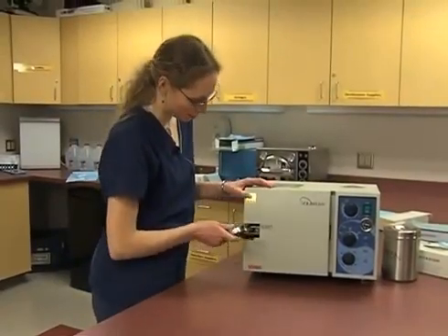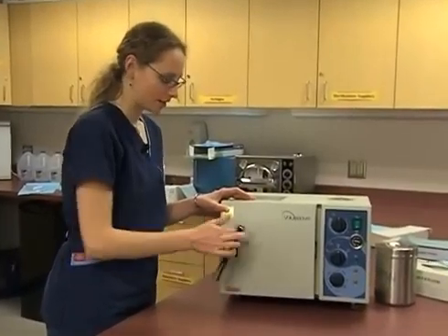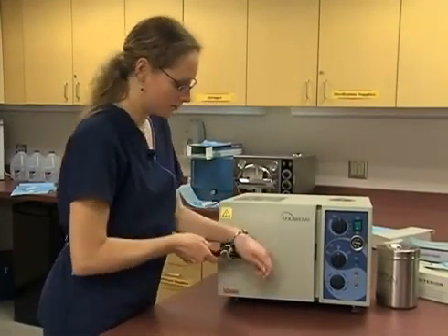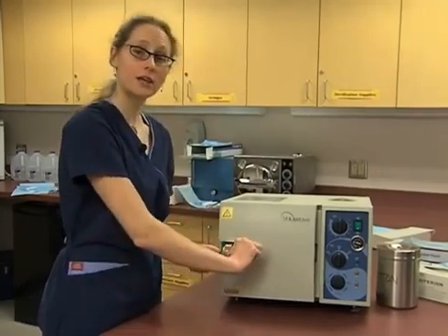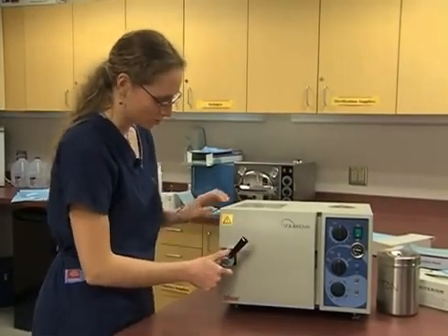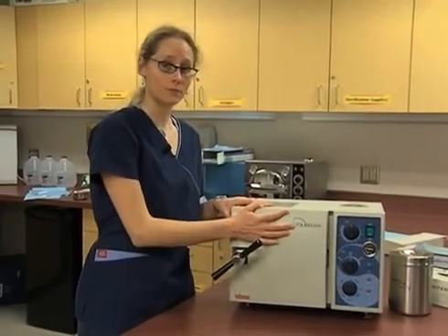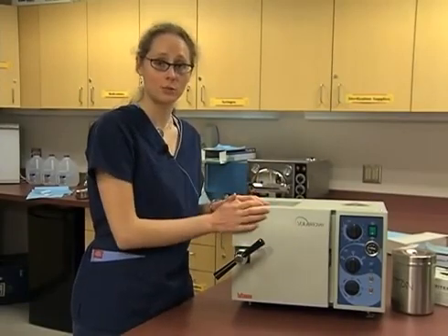Now we'll want to secure the door. Each system is going to be different. In this case, we have a crank to make sure that the door is secured and tight. Other autoclaves have a gasket system and a latch. In this type of system, we want to make sure that this is really nice and tight, because we don't want this to open up, and we need it to reach a certain amount of pressure, so that chamber has to be sealed.